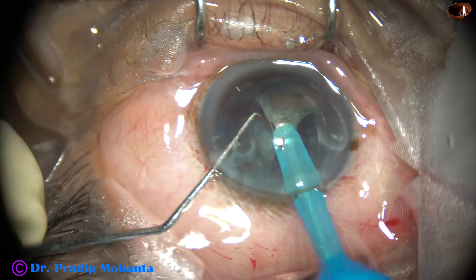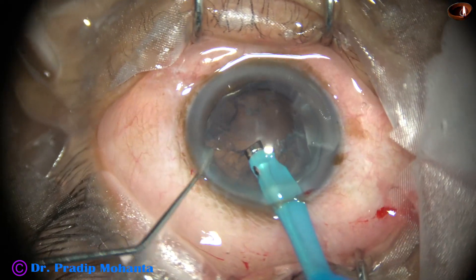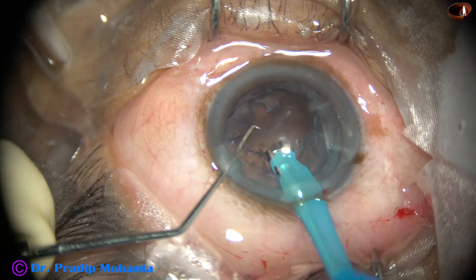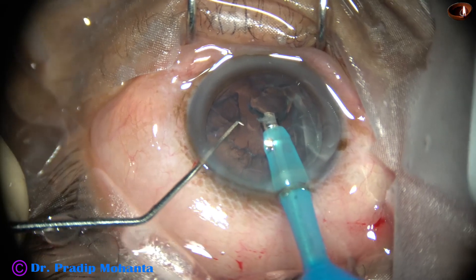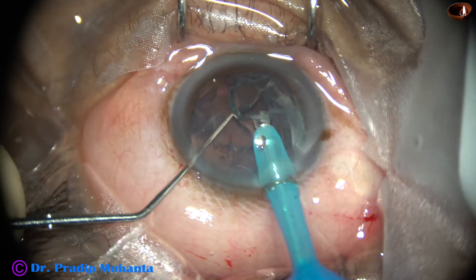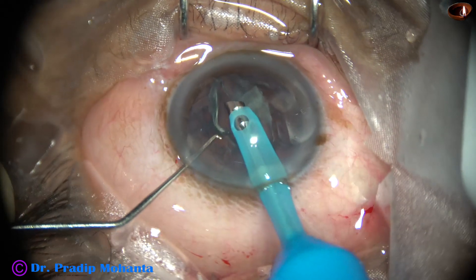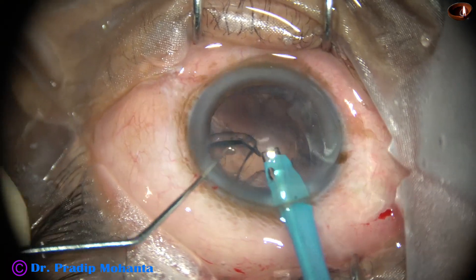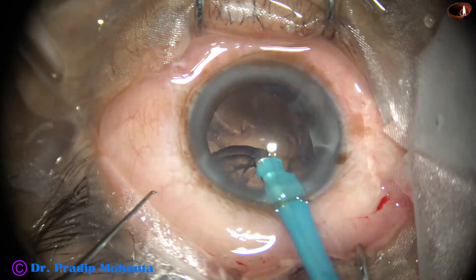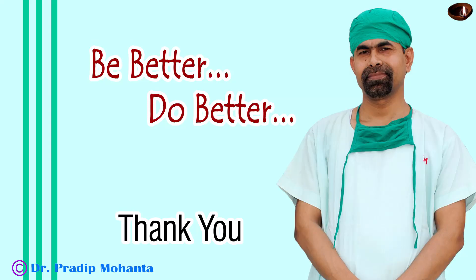This is a very good way of getting cooperation from the patient. Whenever you face a situation where you are doing surgery under topical anesthesia and the patient is not able to cooperate, is having more photophobia, or cannot follow your instructions, just give 1.5 ml of lignocaine in the sub-Tenon's space. It will take less than one minute and it will get you more cooperation from the patient.